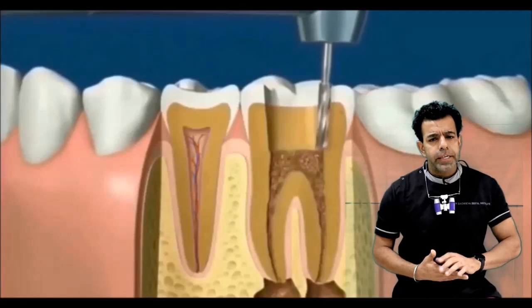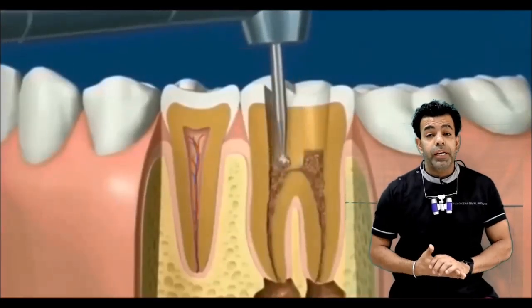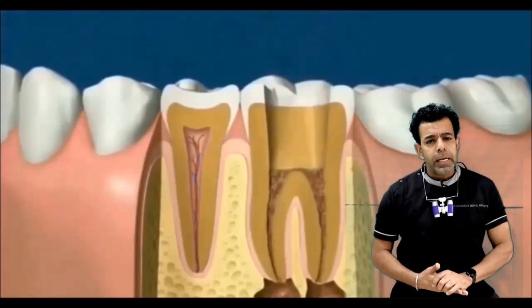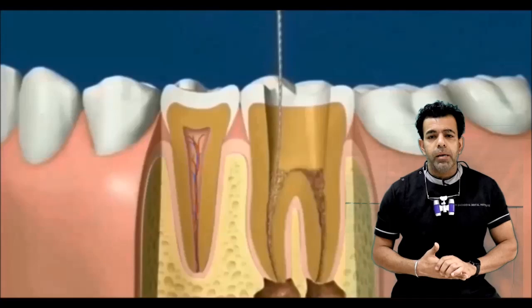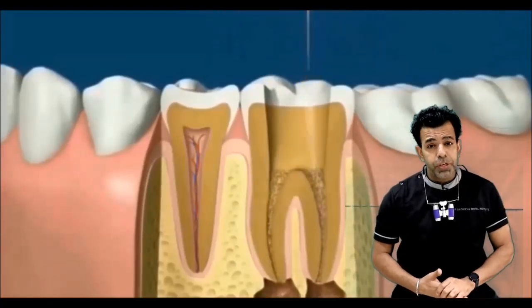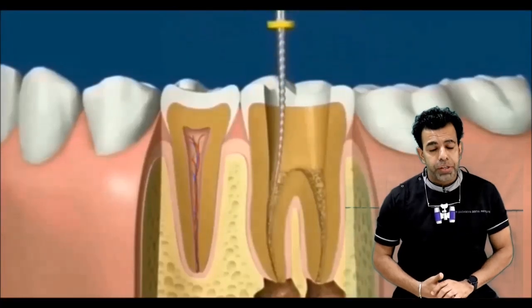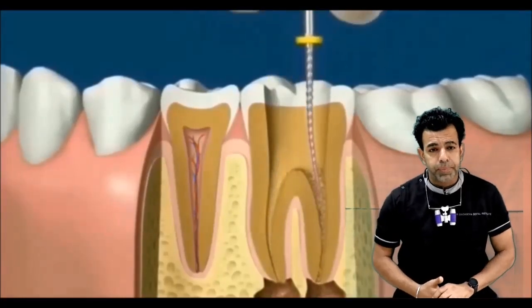Now, due to various reasons, it becomes necessary for an endodontist to remove the infected pulp and clean out the root canals and fill that space with a sterile material to prevent further infection. This procedure is called endodontic therapy, or popularly known as a root canal treatment.